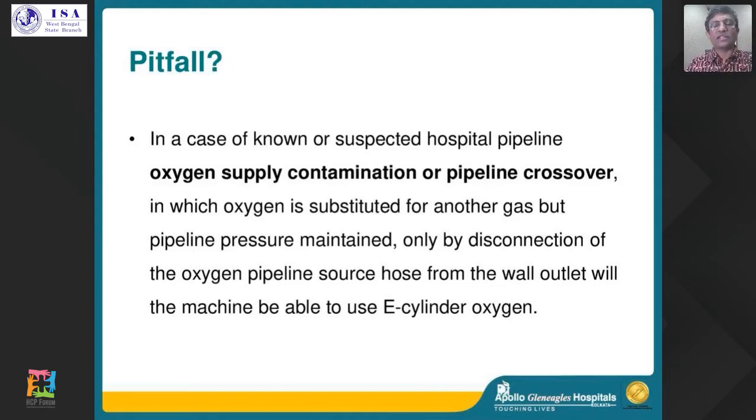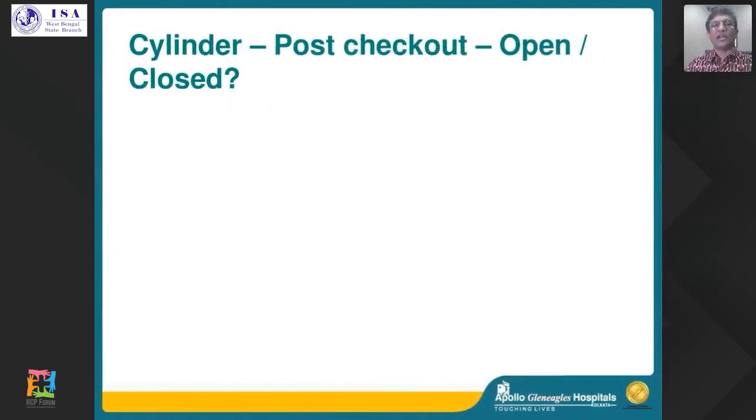It is because even if the oxygen cylinder is open, it is at a lower pressure than the pipeline pressure, so the pipeline gas gets in. So that is why I am referring to Robin Cook's Coma, you will figure it out. The same question then comes up from the beginning.